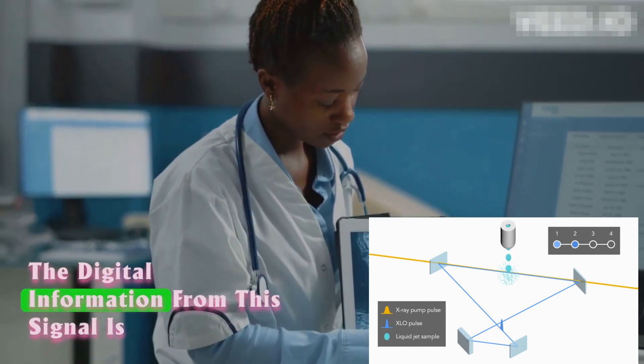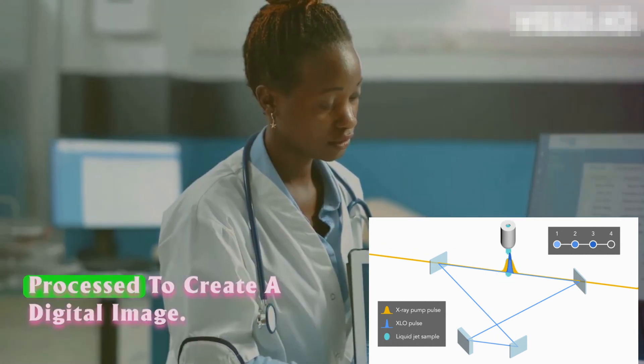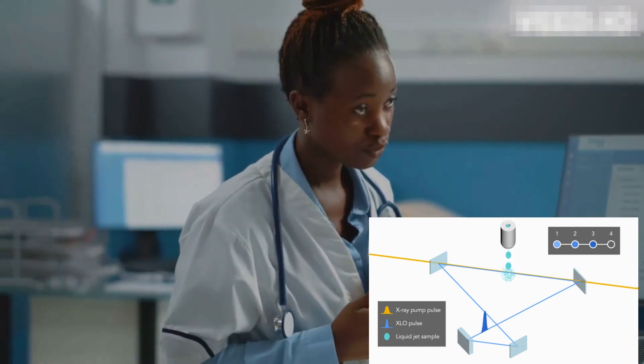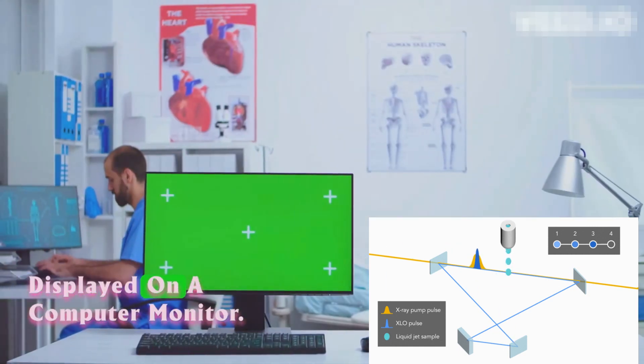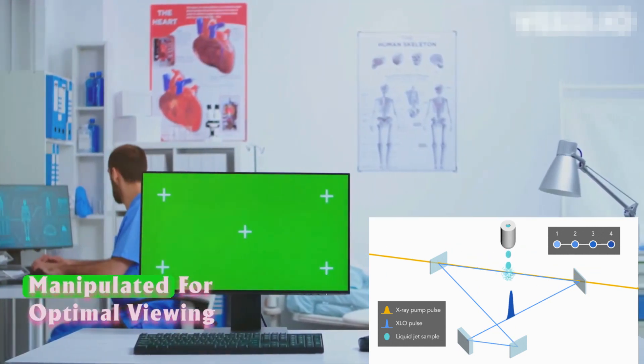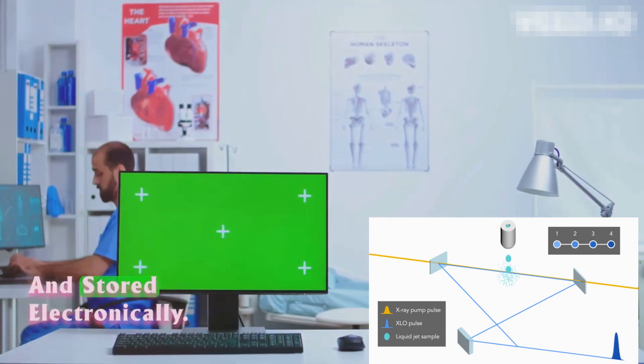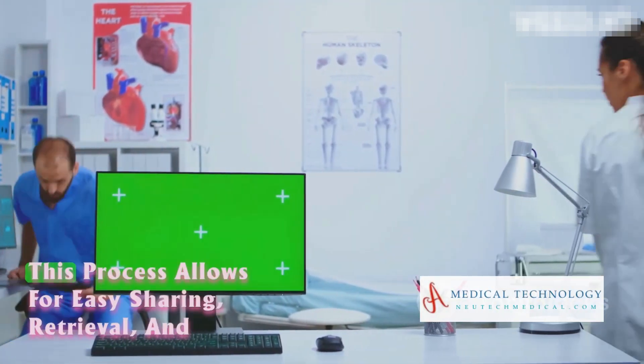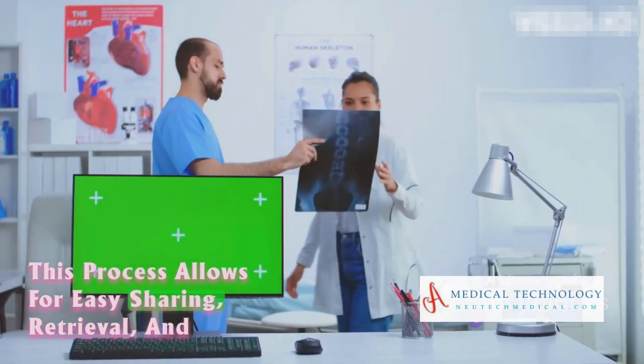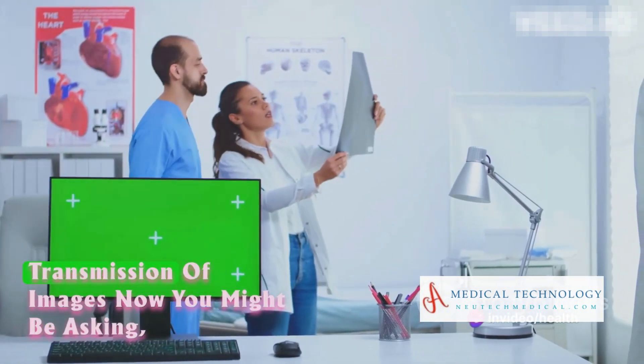The digital information from this signal is processed to create a digital image. Finally, the digital image can be displayed on a computer monitor, manipulated for optimal viewing, and stored electronically. This process allows for easy sharing, retrieval, and transmission of images.